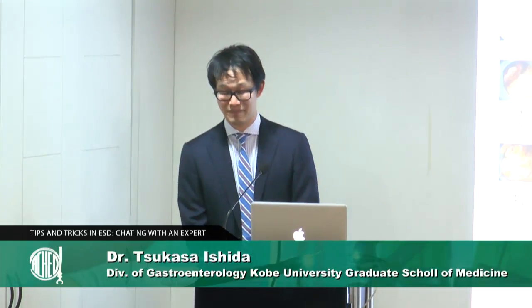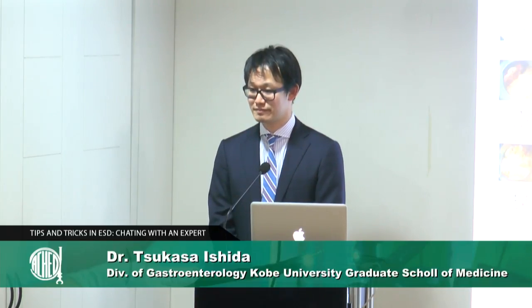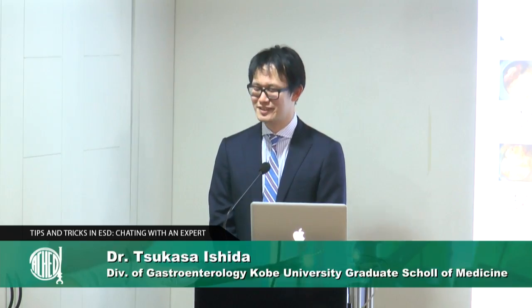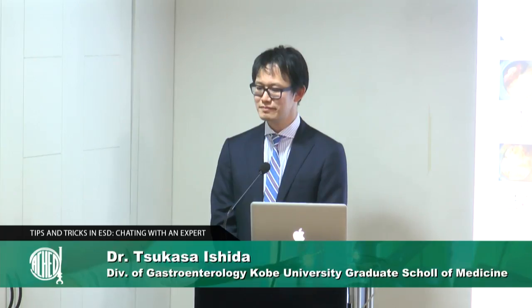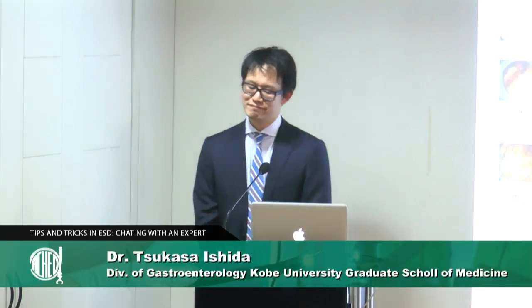I would like to go further on that question. As far as I know, there are three main methods for facing this kind of lesion, from less to more expensive or complex. The first one would be pressure in the stomach of the patient. Then you can have the monoballoon. And last, you can use the double bending scope. So what do you think is more effective, or your preference among those three methods?